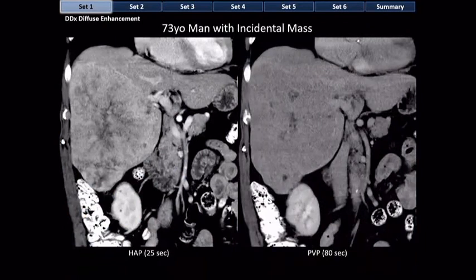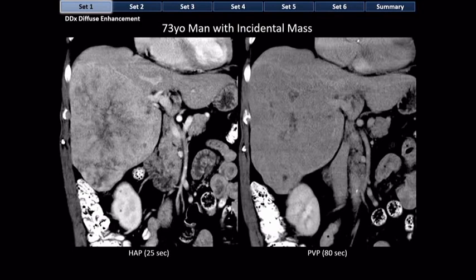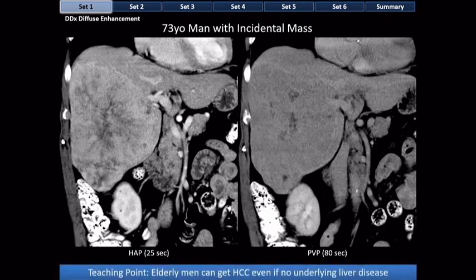Elderly men, even without cirrhosis, can sometimes develop HCC. HCC is thought to be partly driven by testosterone, and there is a clear male predilection. When you see a large heterogeneously enhancing mass in an elderly man, even in the absence of cirrhosis, and assuming no cancer outside the liver, think HCC. Older men without cirrhosis do in fact get HCC — you'll probably see five cases like this a year as a radiologist.